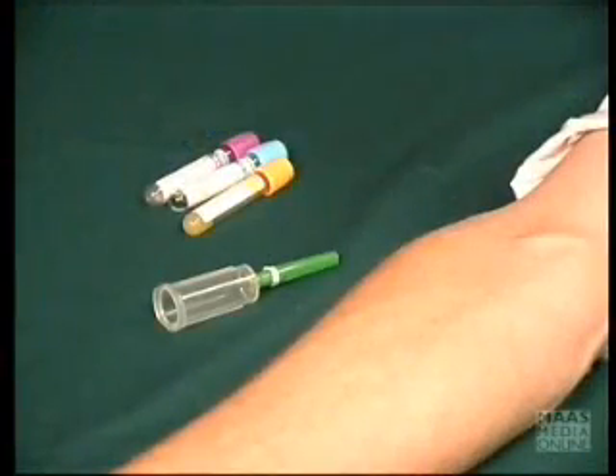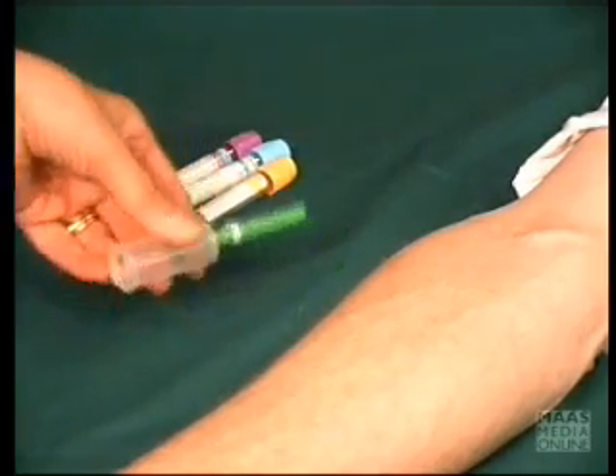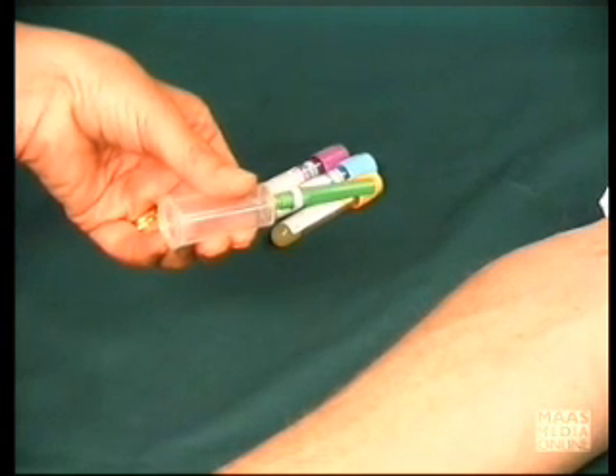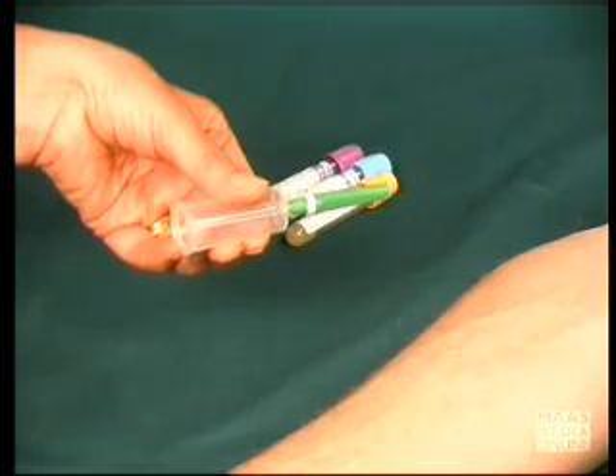When you're ready to perform the venepuncture, make sure that your required sample bottles are close to hand and that the needle holder has been assembled. Pick up the needle holder quite naturally so that your thumb is on top and the fingers to one side, and you have a clear view of the needle holder.